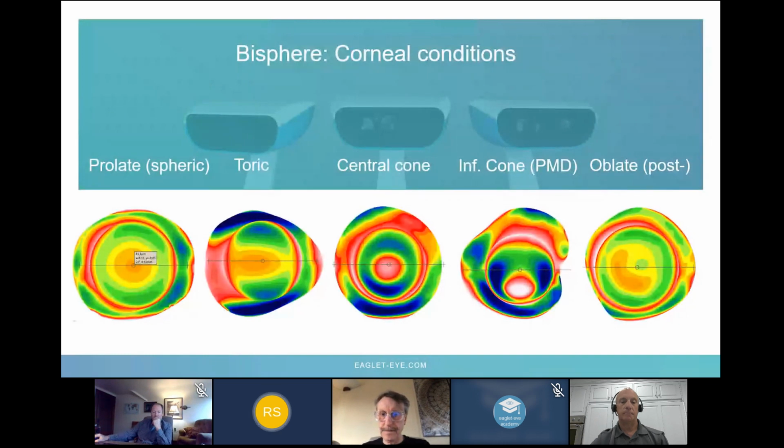Stephen Matthews, how much of this information can be acquired by observing the blanching pattern under a trial lens? That's a very hard question. Well, I'll jump on that. That's the way that we've all done it, and I've done it for years, and we did a pretty good job. But, as in the case I'm going to present in a bit, things are a lot different than we could actually observe. A lot of times you'd say, oh yeah, there's that blanching area, I have to flatten it out in that area, but then what's going on in the other meridian that we seem to ignore? And that will affect how the total lens fits.